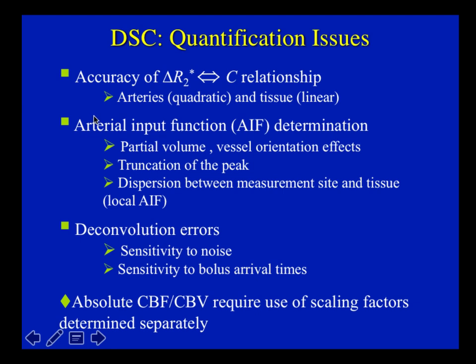So even though we have a good way to come up with these parameter maps, there are errors in different steps in the calculation of these maps.